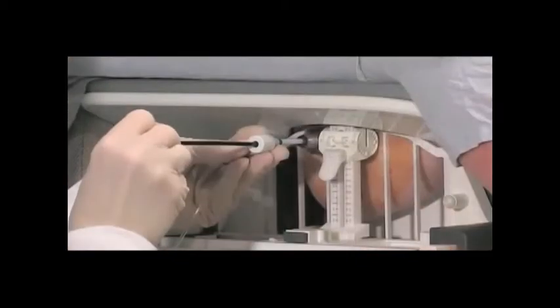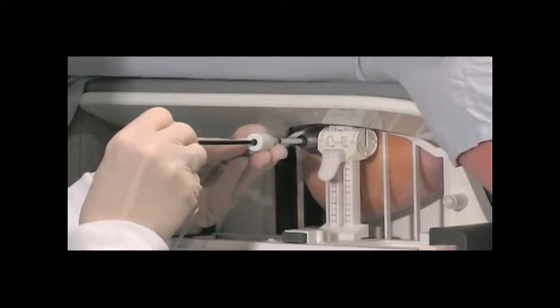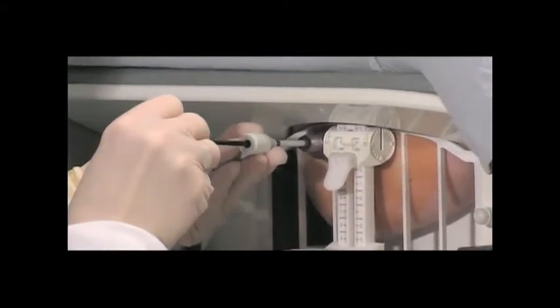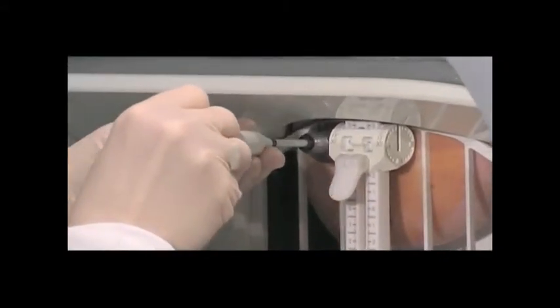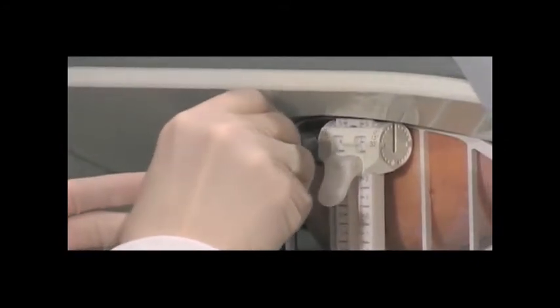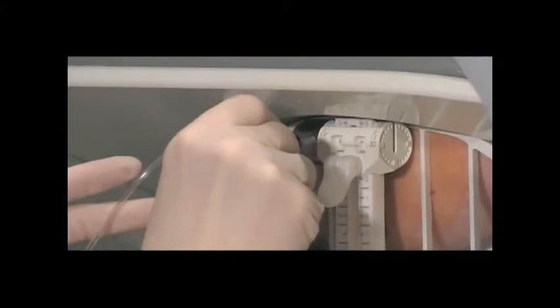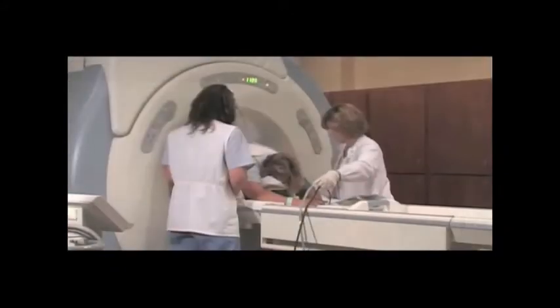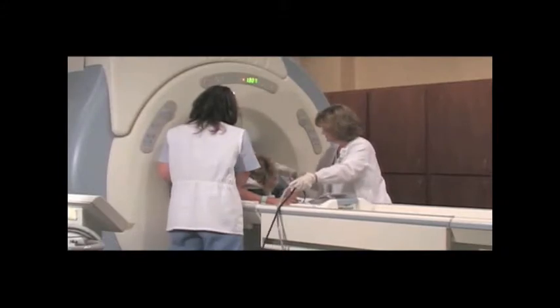Place the localizing obturator into the introducer sheath. Make certain that all instruments placed into the introducer sheath are inserted completely, hub to hub. Ensure the side arm of the introducer sheath is tucked in to avoid catching on the magnet. Shuttle the patient back into the magnet.